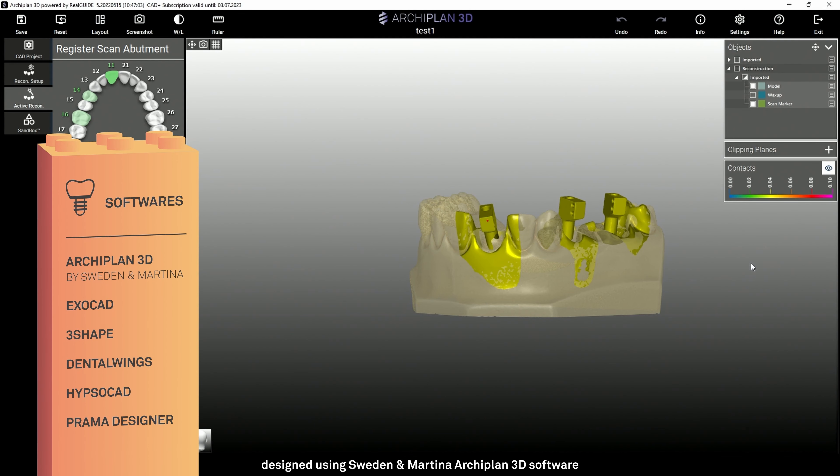Let's see an example of digital use of these components. I'm using Sweden and Martina's Archiplane software, but the libraries are also available in Exocut, 3Shape, Dental Wings, Hypsocut, and Prama Designer.